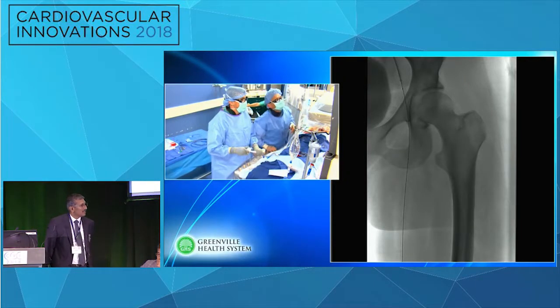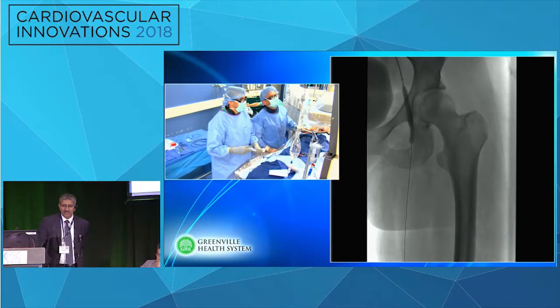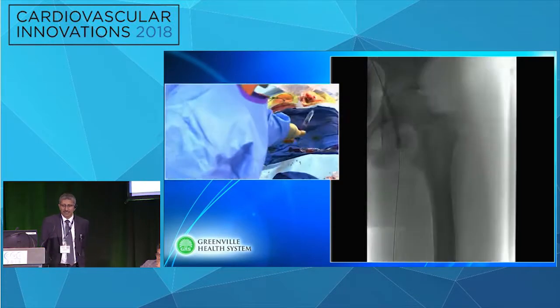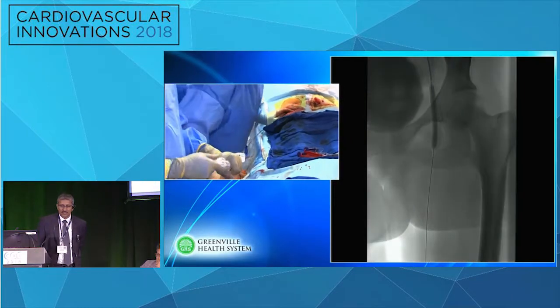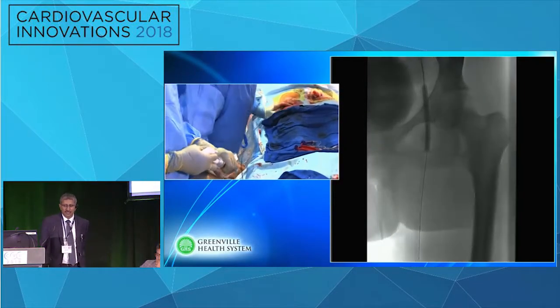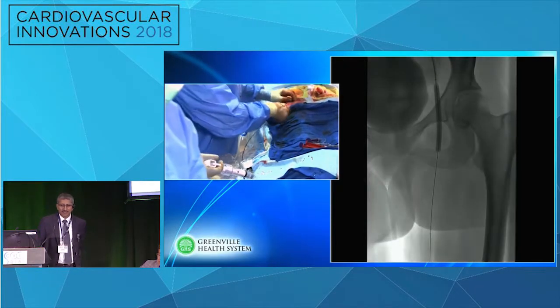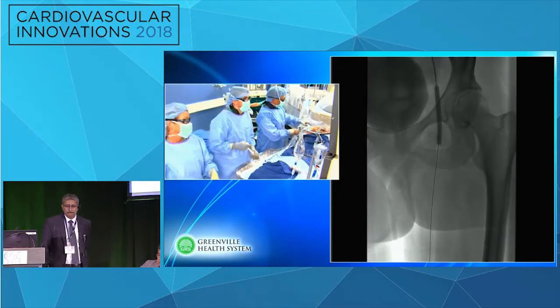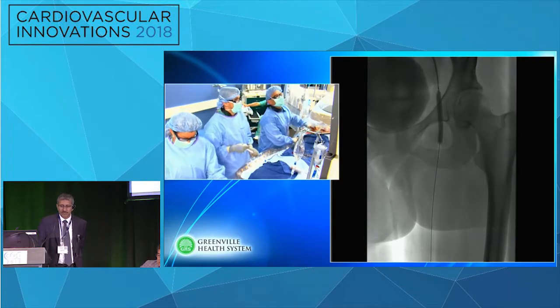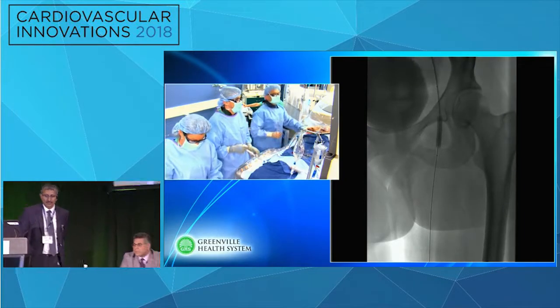Isn't that too medial to be the femoral vein? You think you are in the saphenous? What's that? Yeah, Bruce, I think you're in the saphenous vein, aren't you? I mean, maybe that's what you want to be your inflow, but I would look a little more towards the deep, towards the lateral aspect, to try to see if you got into the deep. I don't know. I'm not an expert in the veins as much as some of my colleagues here on the panel.